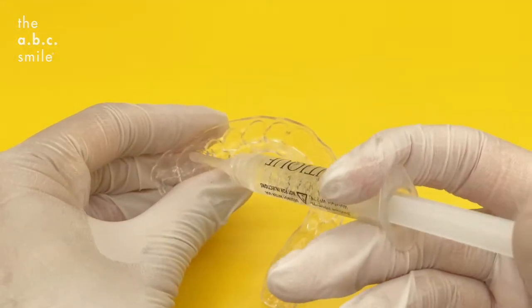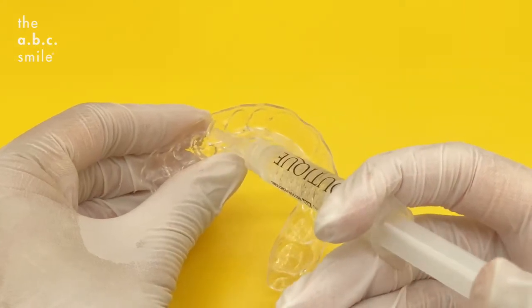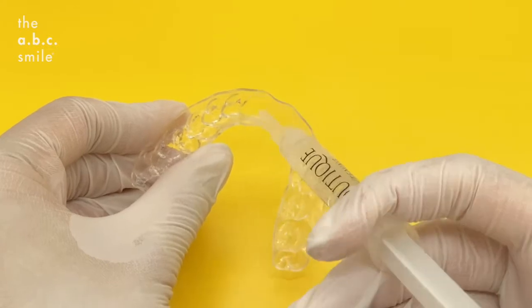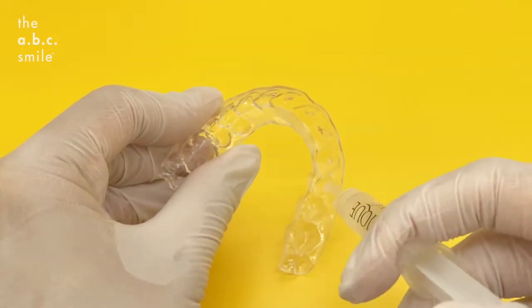When loading your gel inside your whitening tray, place a small dot on the outer surface of each tooth. Place the dot of gel at the center of each tooth. With some practice, this will become very quick and easy.